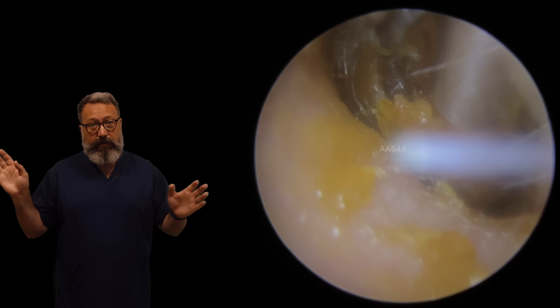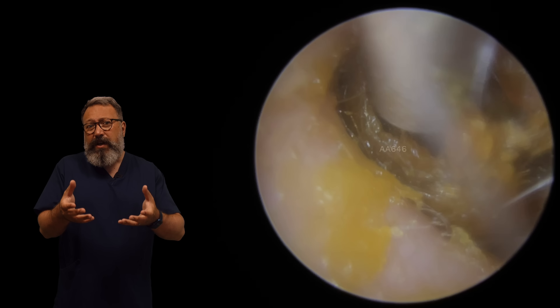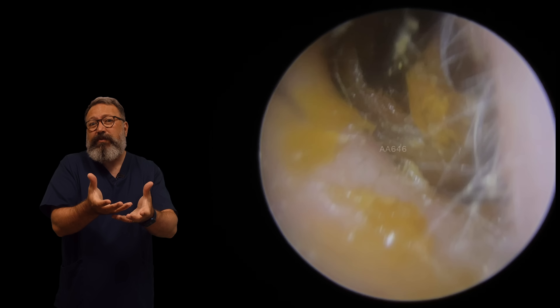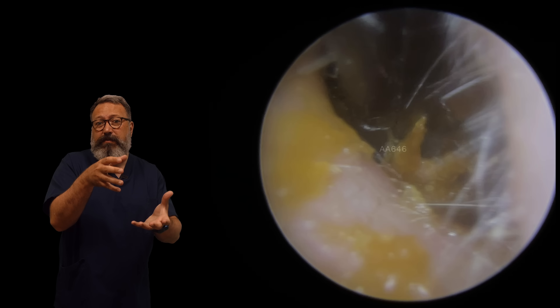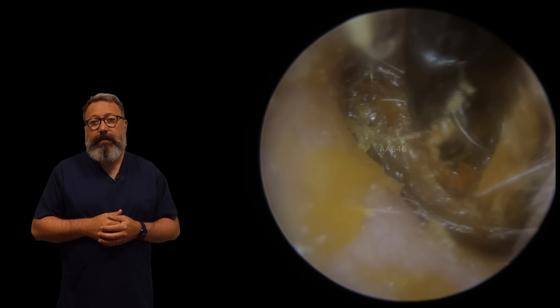As I'm pulling this forward, can you see that layer around the outside edge that's pulling forward with it? So we're going to drop back in now with the forceps to get rid of that layer. It's just starting to pull forward.